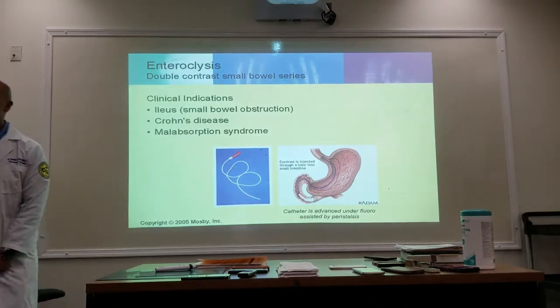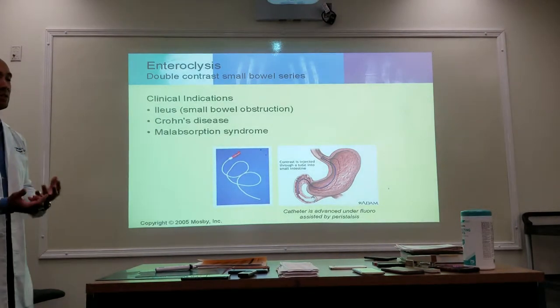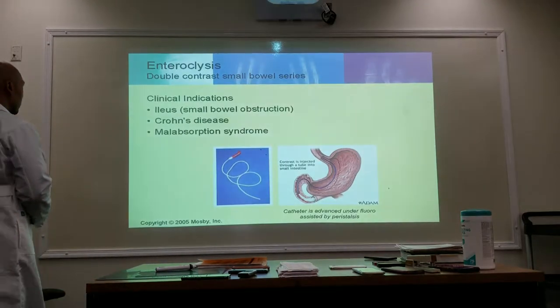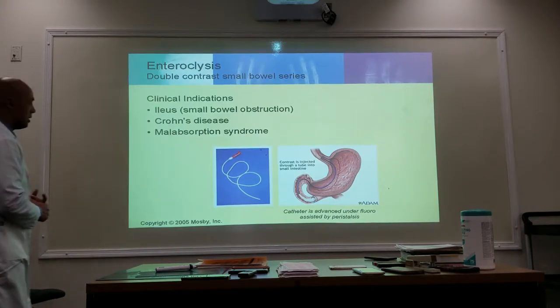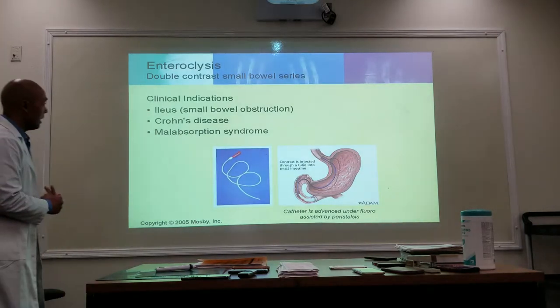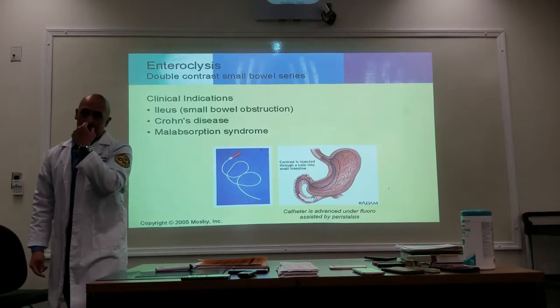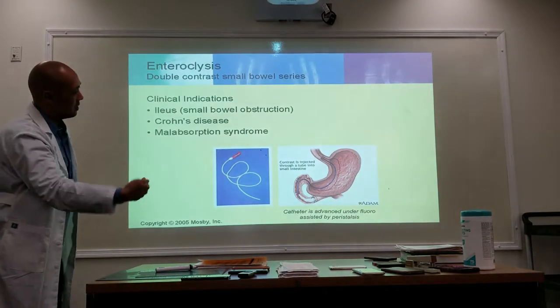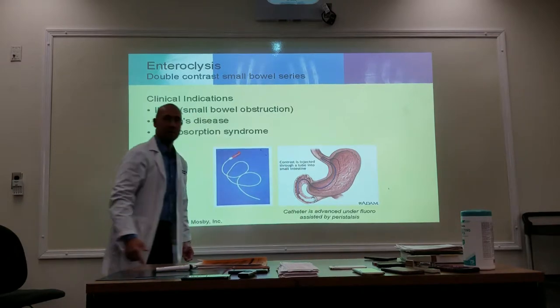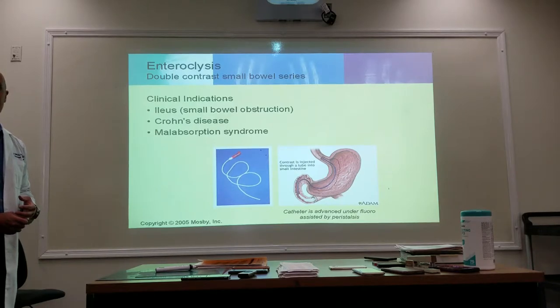Okay. All right, so the next few slides I'm going to be sharing with you are the special types of small bowel series. This one involves putting an enteroclysis catheter down into the stomach and proximal duodenum. This tube is going to be inserted through the nose, possibly through the mouth, going down the esophagus, through the stomach, into the proximal duodenum, and this is done under fluoroscopy.